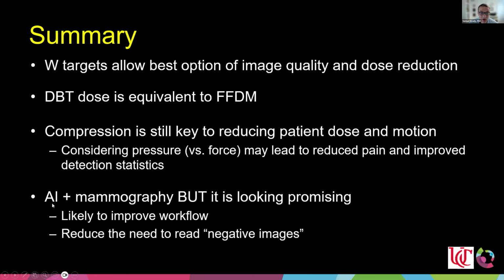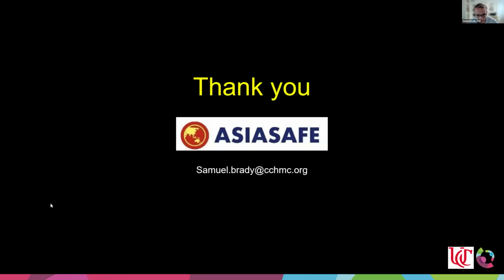And AI plus mammography is the future. We need to have studies that are very specific to the populations in which they'll be used. So in Southeast Asia, if you haven't already, you need to have these AI models developed from your population to reduce the bias effect that you would see if you used off-the-shelf technology developed in Europe or America.